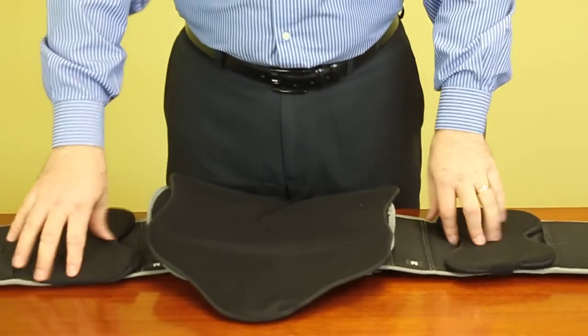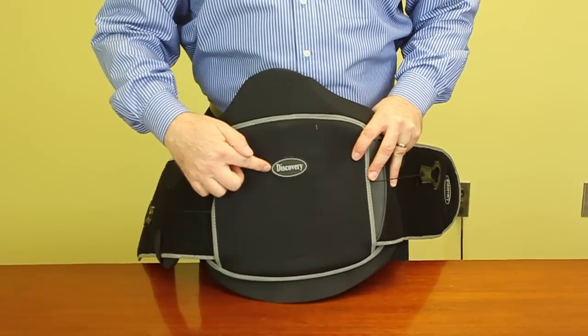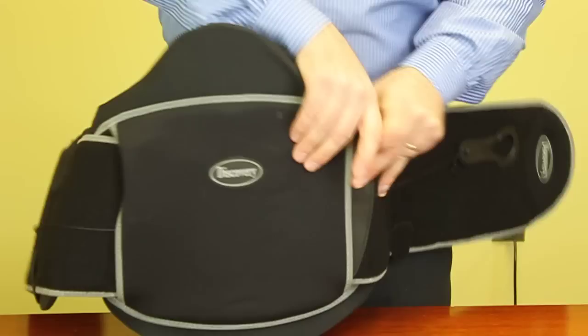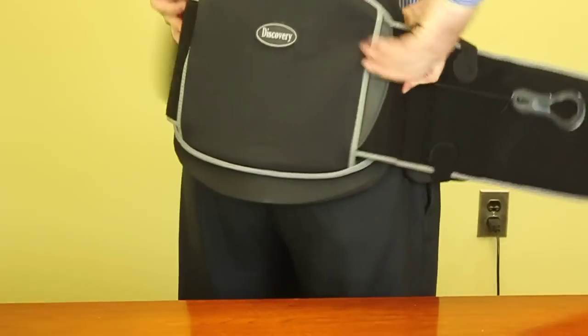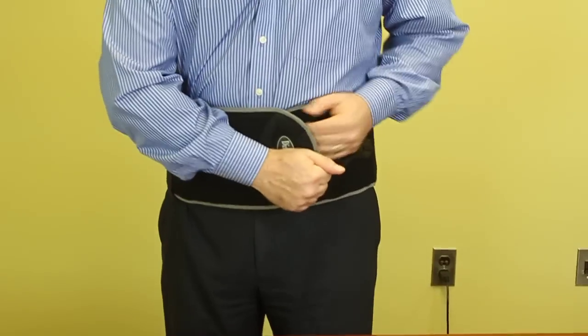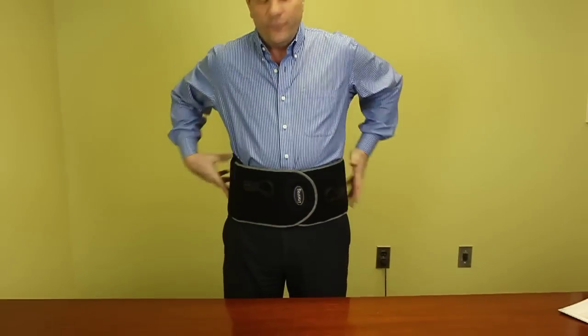Now, in order to use the device, just flip the device over — you see where you have 'Discovery' on the back — make sure that that is up and readable upwards. Just put it to your back like so, take the side panels, set that up. It's got a Velcro, nice, comfortable fit.